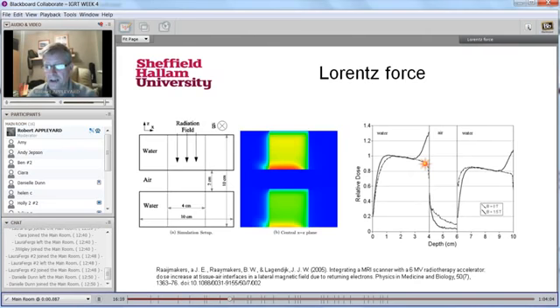But what you see with the MR-Linac is this big increase in dose at this tissue-air interface here. This change in expectation here, and again this increase in dose at the exit point here. So these are fairly major considerations as a result of the secondary electrons being attracted back to the magnet. That's what happens here. You get lots of secondary electrons produced here, and they're all being attracted back to this main magnetic field.